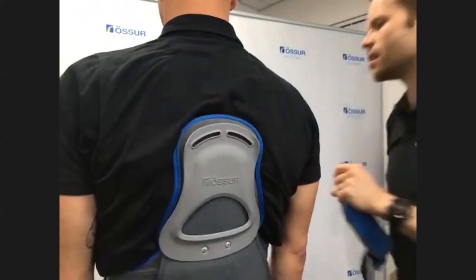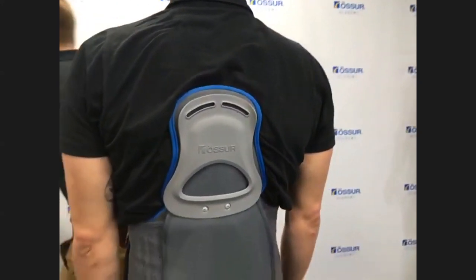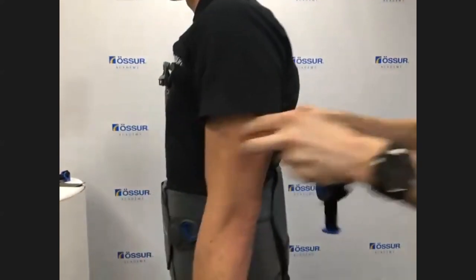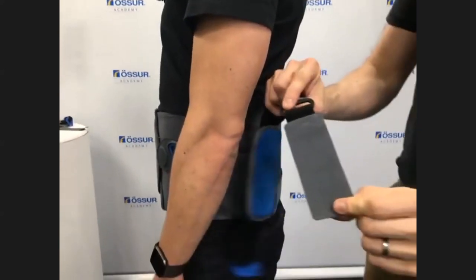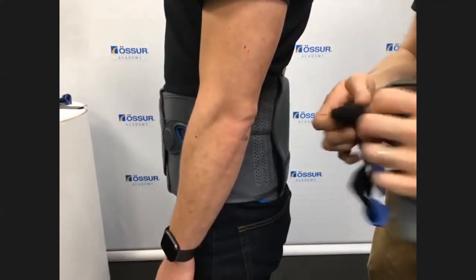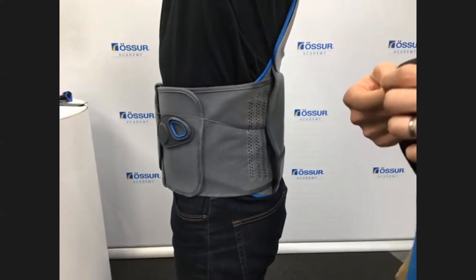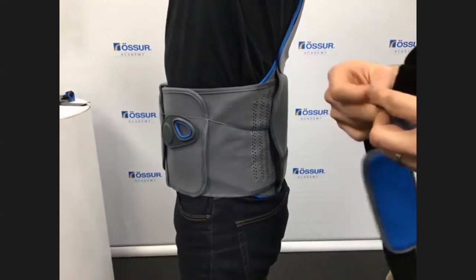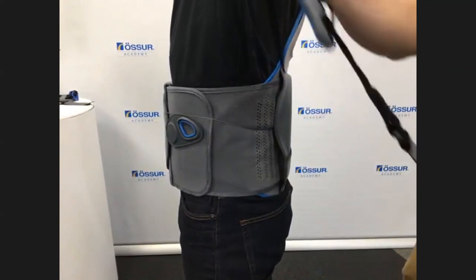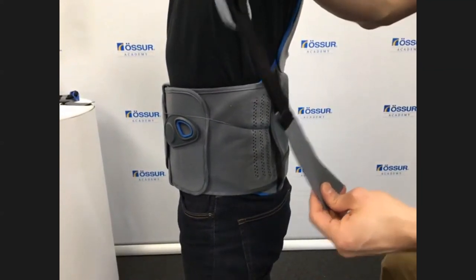Okay, so we're utilizing the same straps, and then I'm just going to go and grab these pads. So these are strap anchors, and if I show you these, you can see these are included in the kit. Now if I can get you to lift up your arm, Pete. So what we would do is this would normally be applied when the patient is lying down, but I can quickly show you how we would then set this up.